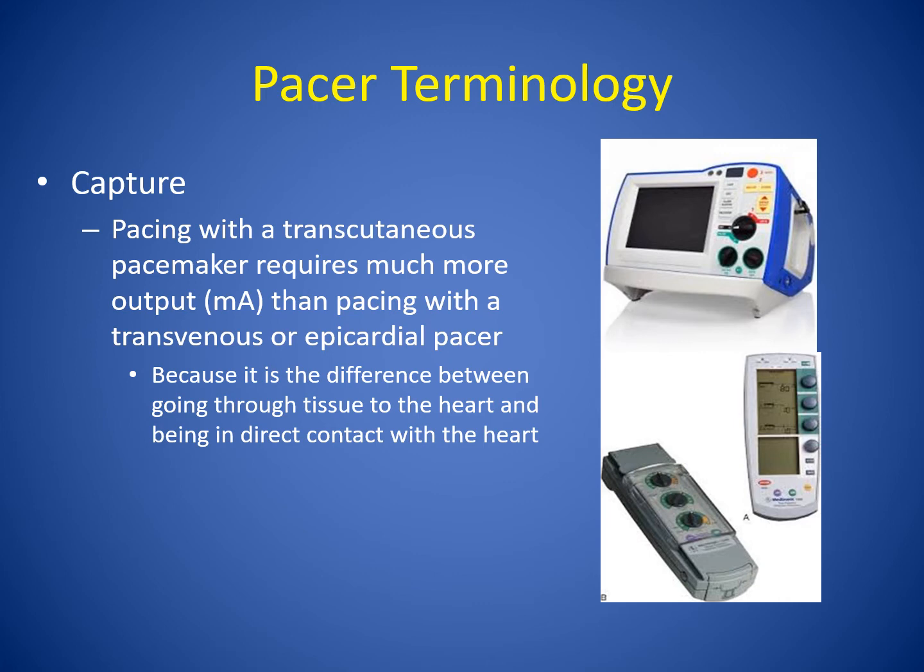Transcutaneous milliamps usually would run between 50 to 140, as opposed to transvenous and epicardial, which would be 0.1 to 20 milliamps.